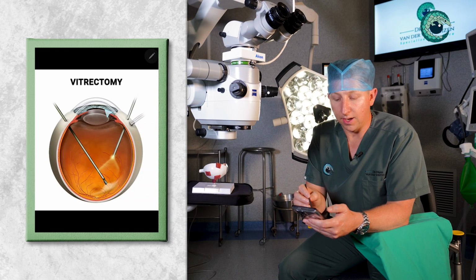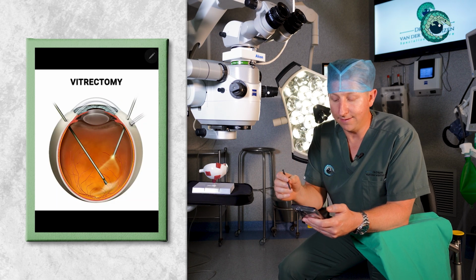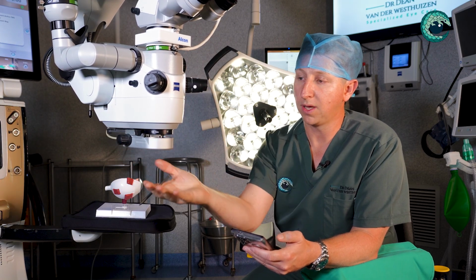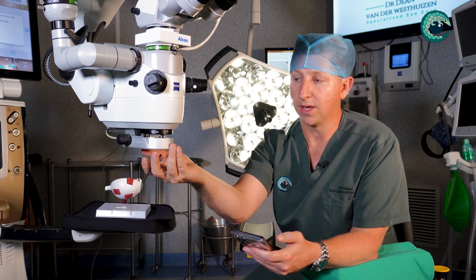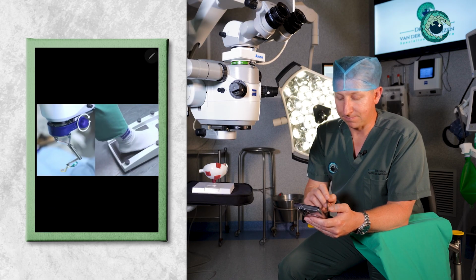To see the back of the eye, we look through the pupil. So, like most eye surgeries, we dilate the pupil up so we can see the back of the eye. And then we use a viewing system. That viewing system is attached to the microscope. It attaches to the bottom here and has some special lenses that allow us to see at the back of the eye. I use the Zeiss system, so I use the Resight.